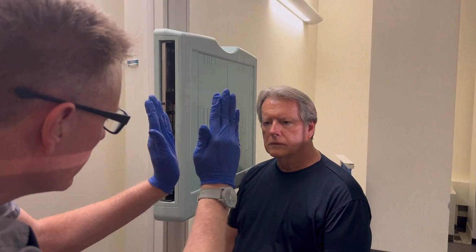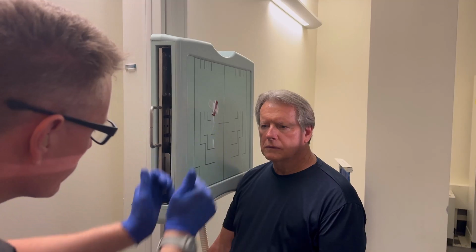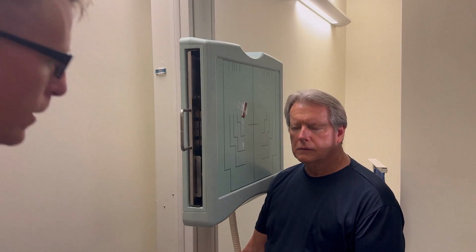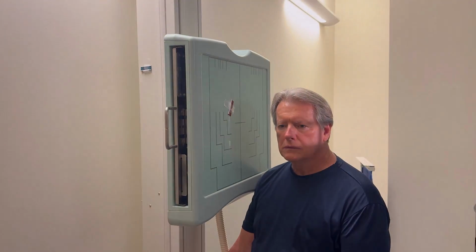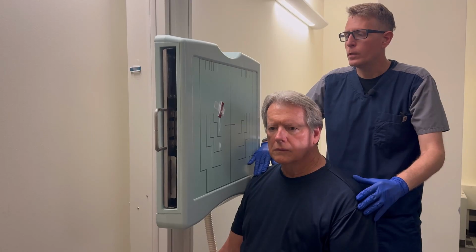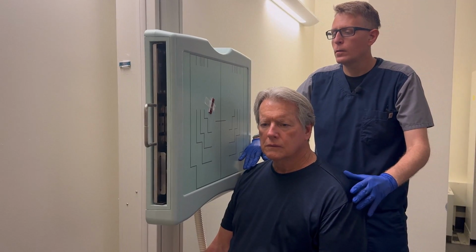You look at me. We're going to tilt your head slightly. That's good. And then turn your head to follow my... Stay right there. Just expose on suspended respiration. Okay.